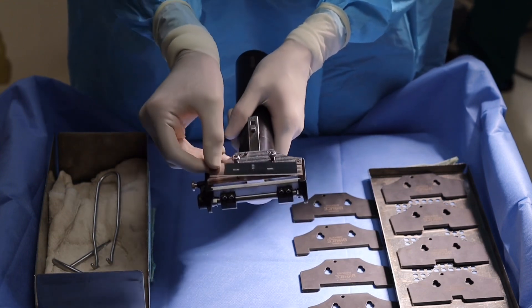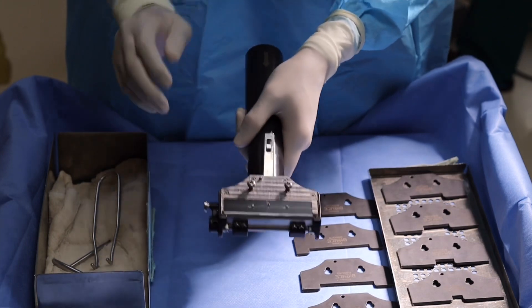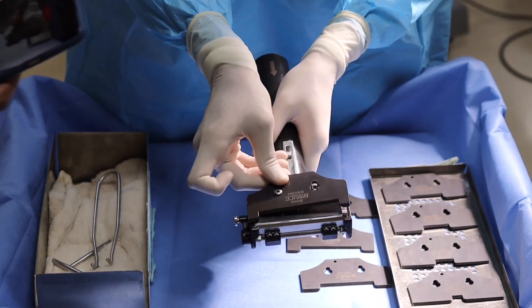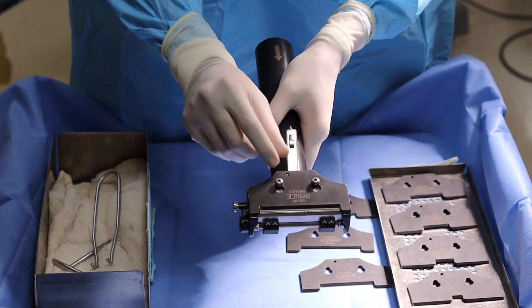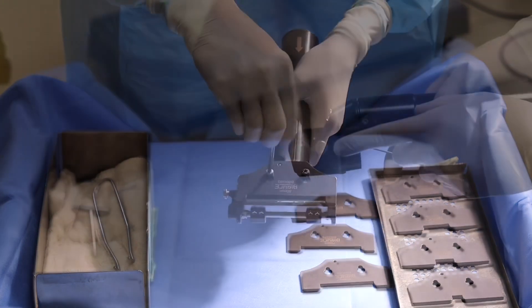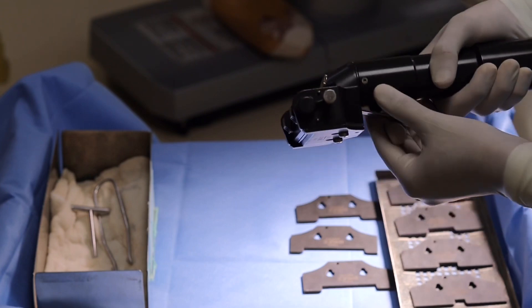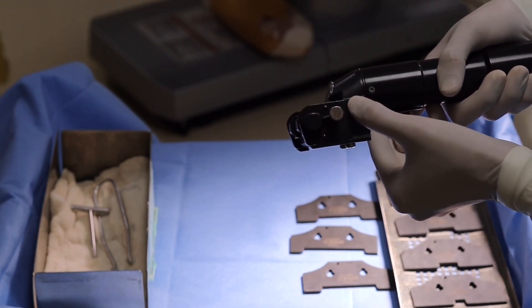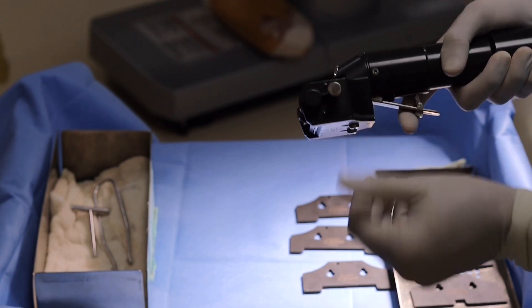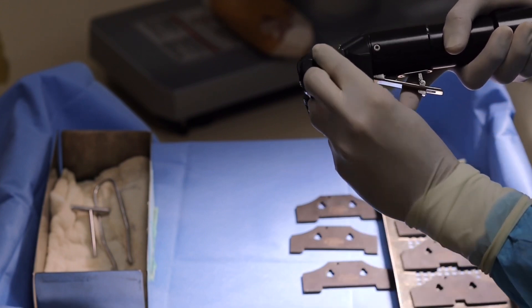Now we have to insert the blade and adjust as shown here, and take a graft plate of your preferred size. In this case I am using 80 mm, that is 8 cm graft blade, and I will fix it with screws. I will adjust the thickness by using the lever at the side of the dermatome. The thickness ranges from 0.10 mm to 1.20 mm. I kept it at 0.40 mm to harvest the intermediate thickness STSG.